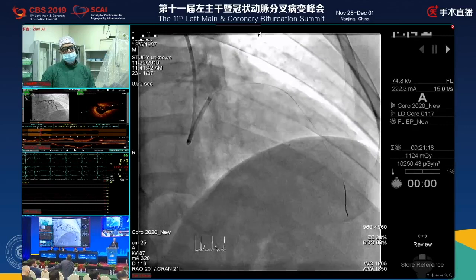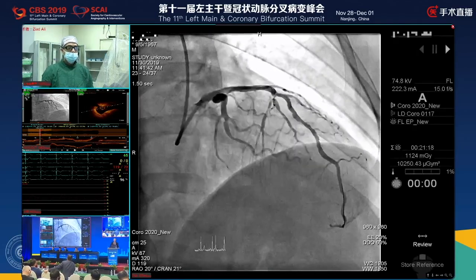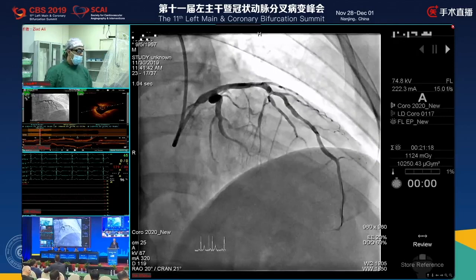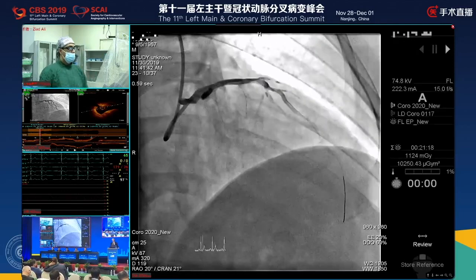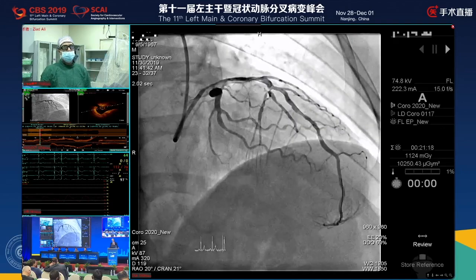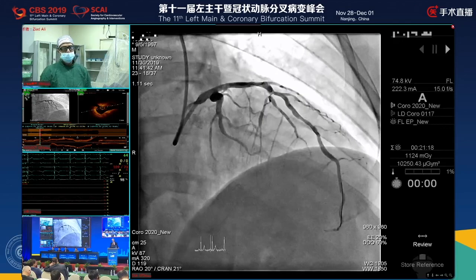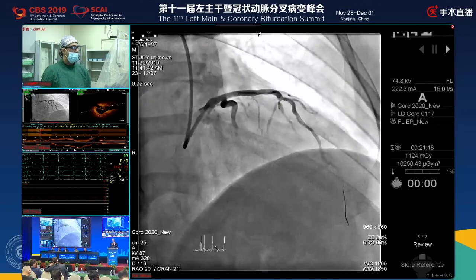Our plan was to do an Angio-FFR. I mean, the likelihood of us moving the calcific protruding nodule was exceedingly low. And we made sure to not focus our balloon in the LAD. But since we paid for the catheter, yeah, absolutely, we'll do it. And if you guys have time to come back, we'll show you the post-PCI FFR as well as the post-PCI OCT.